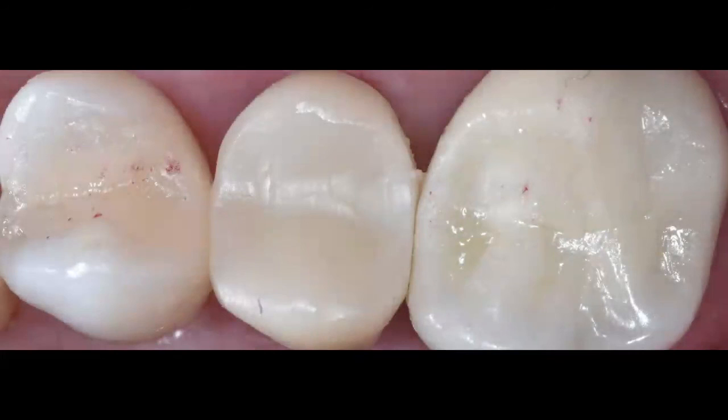I fabricate my temporary, placing a thin layer of Vaseline on top of my core buildup, because don't forget, the core buildup is composite. The temporary that I'm going to use is bisacryl, which is also a composite. It's a resin, so they may bond together, and I don't want that to happen. So I'm going to put some Vaseline on the prep. I go ahead and put my bite registration material inside the patient's mouth, fabricate my full crown temporary as you're seeing on the photo, and then I go ahead.